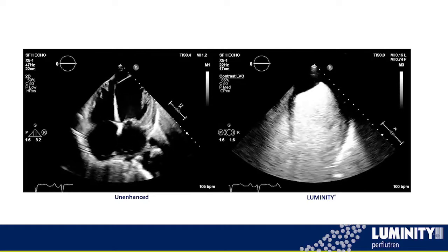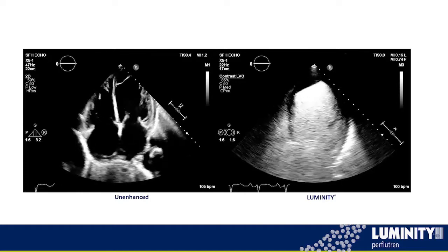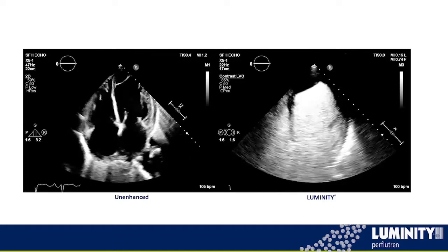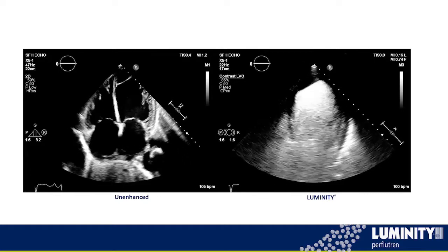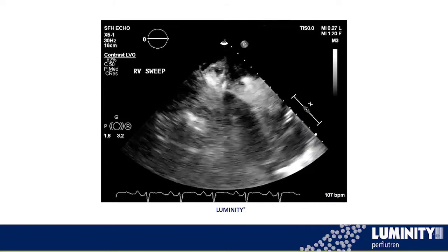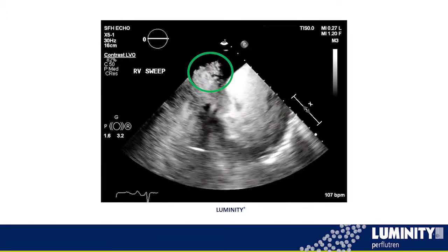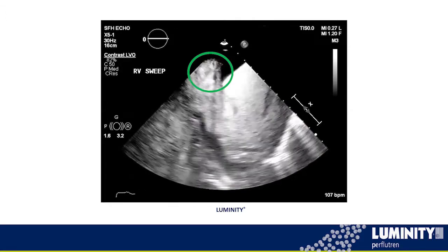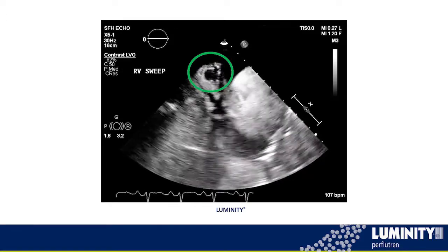In this patient, what's also important, we mentioned sweeps, is to not forget about the RV, right? If the RV function is down too, we can see the LV mural thrombus in the LV apex. You can see as we sweep through, there's also that black echo density in the apex of the RV, which wasn't seen until this sweep was done.